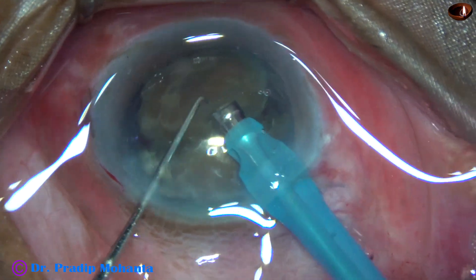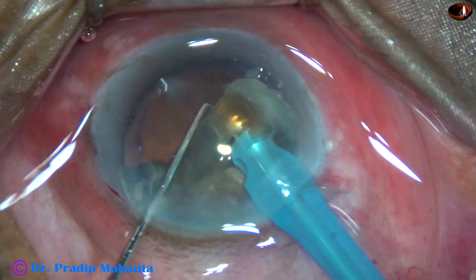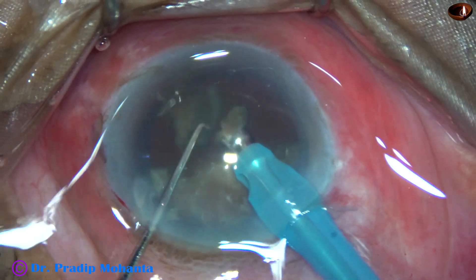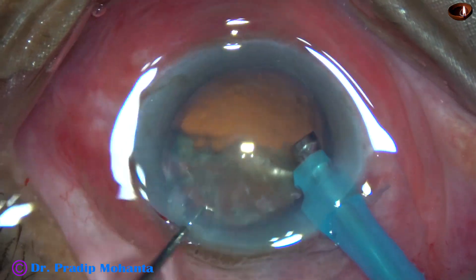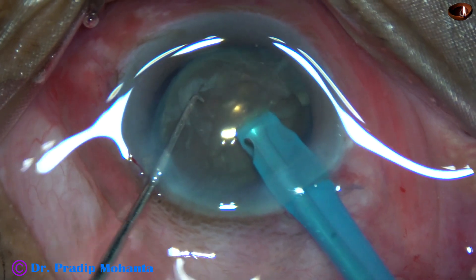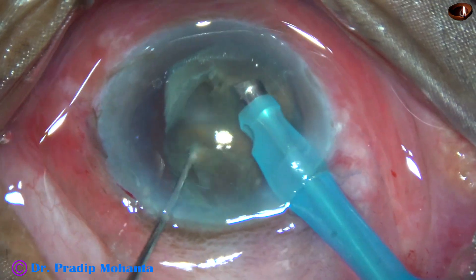The FECO power — the ultrasonic energy used in this case — is 80%. Flow rate is 45 ml per minute. Vacuum is 450 mmHg. So one heminucleus is managed. We come to the other heminucleus. Again, the tube goes through the substance of the nucleus and it is chopped.